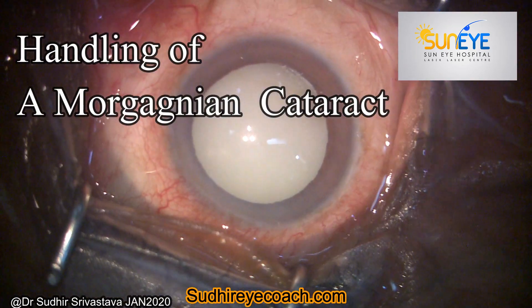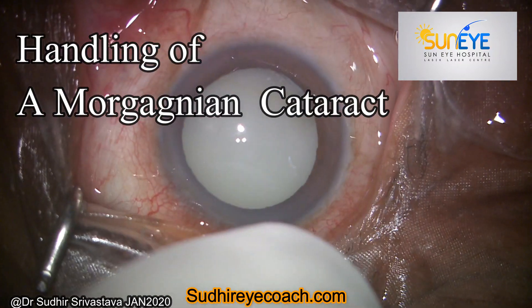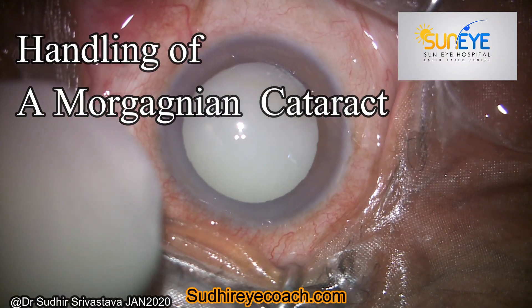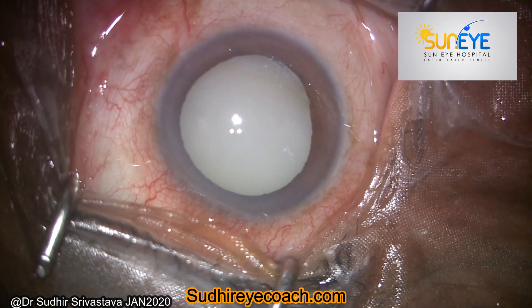Hello everyone, today I would be sharing a video on how I managed a case of Morgagnian cataract which had a small capsular dehiscence in the inferior part. As we all know, Morgagnian cataract is a kind of hypermature cataract.